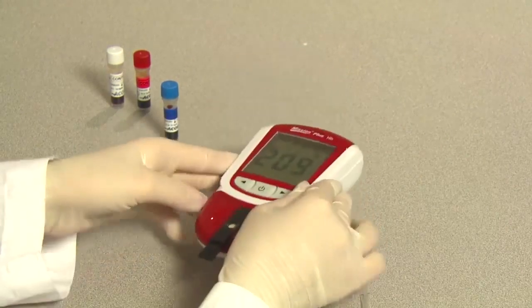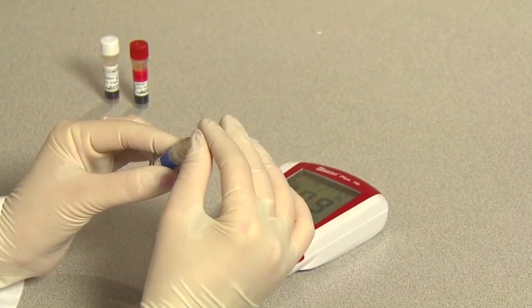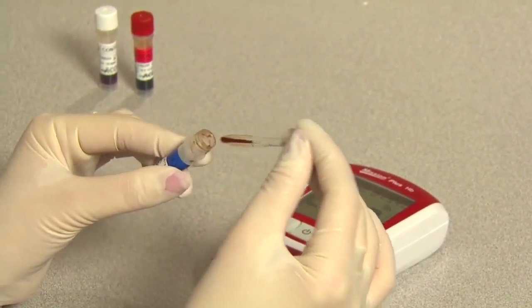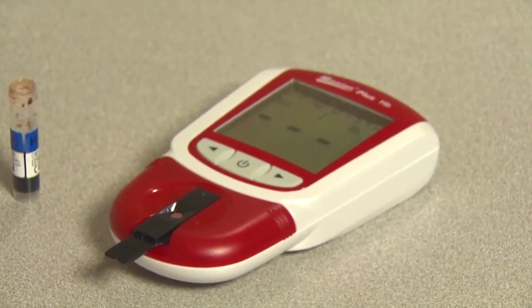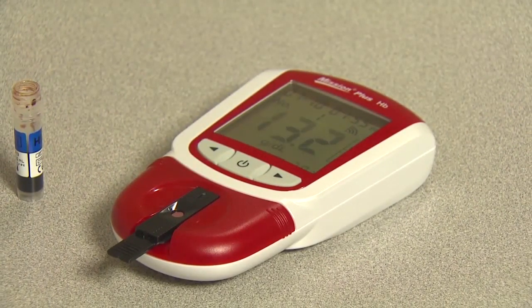While the blood drop symbol is still flashing, use a capillary transfer tube to apply 10 microliters of the control solution to the center of the specimen application area. 3 dashes will appear on the meter to show the test is in progress. Read the results on the screen after 15 seconds.